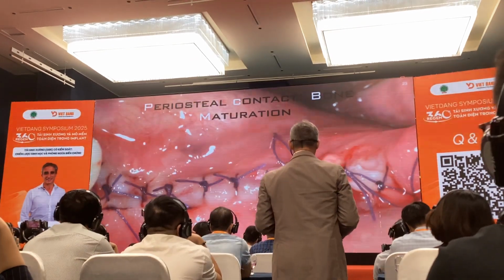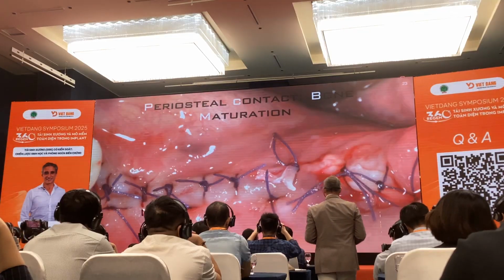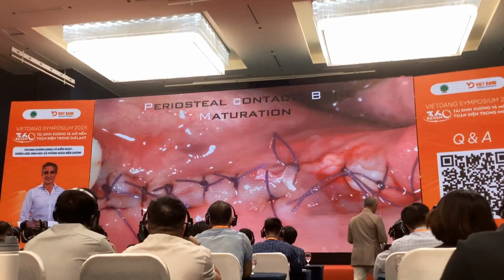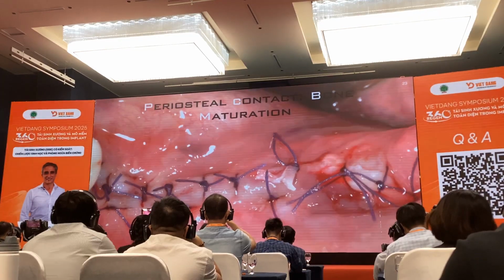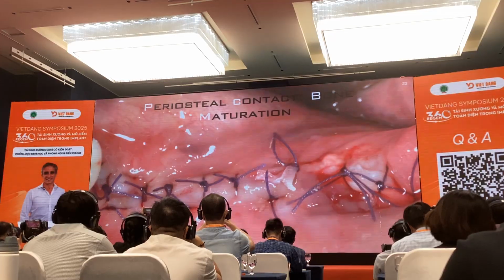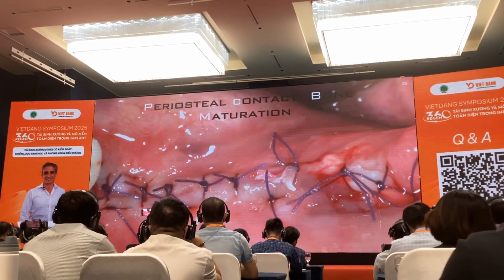And so I close again the flaps in a way that we cannot have any risk of opening of the flaps. These sutures are similar to the GBR suture. It isn't a conventional interrupted suture.